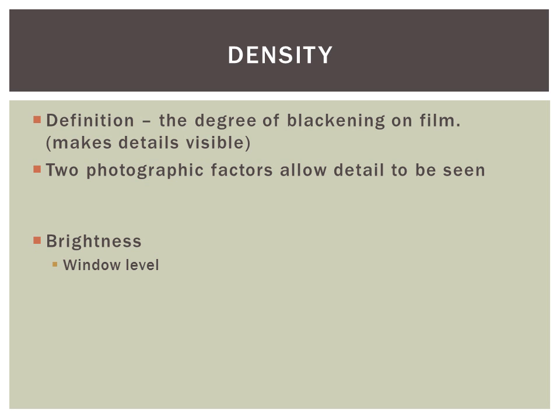Density. Definition: the degree of blackening on film makes details visible. This is created by the exposed silver halide crystals changing to black metallic silver after processing for film. Two photographic factors allow detail to be seen, both density and contrast.